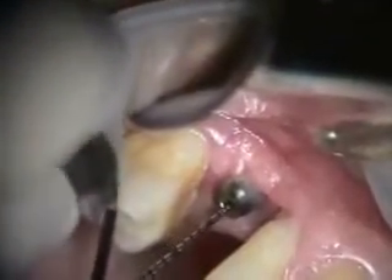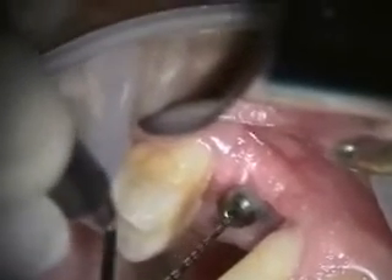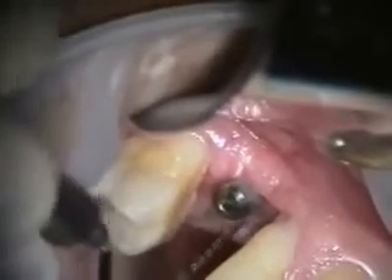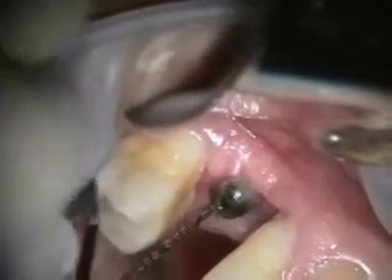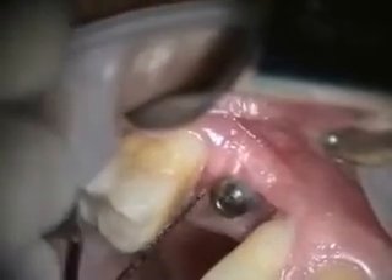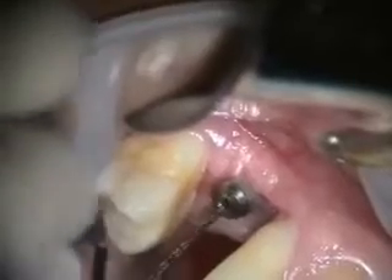Today we're going to be removing this implant in a number four site. You can see it's a little bit mobile. This was an immediate implant and provisional, and then there was some bone loss and some infection, a repair, and now we're going to be removing this implant, grafting this socket, and trying to reconstruct this area so he can get an implant in here.